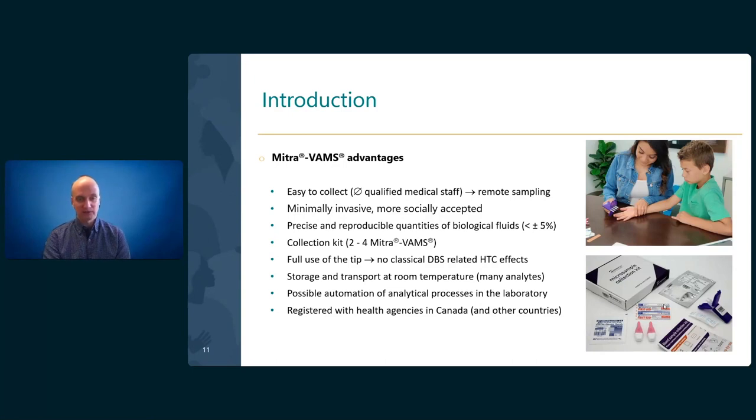It doesn't require qualified medical staff. And obviously, this allows remote sampling, either at home or in the field. Let's say you have a project running in a remote community, so you might use it. Obviously, it's minimally invasive, and in this way, it's more socially accepted.